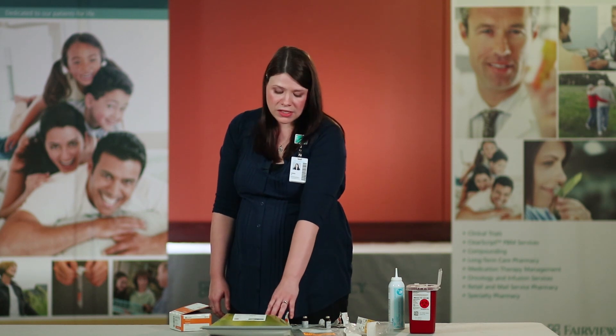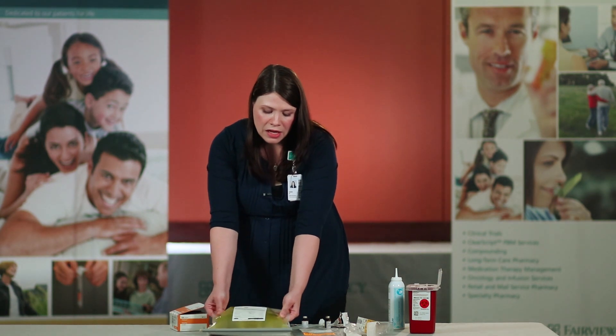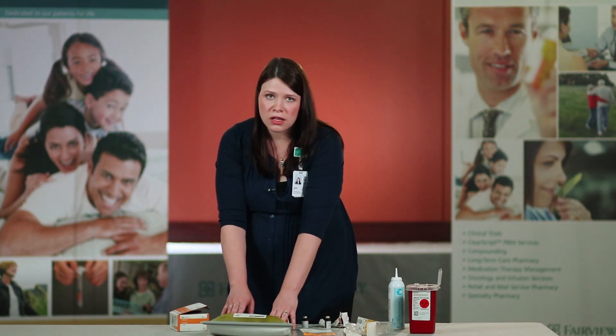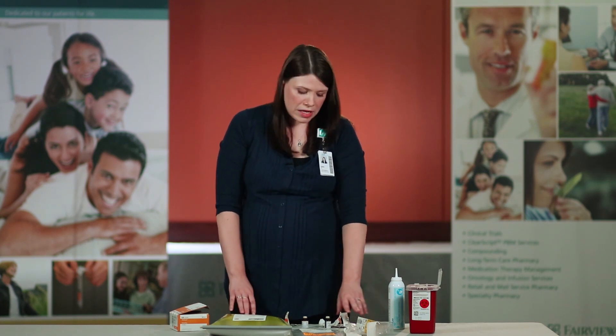It's good to note that one of your vials of multivitamins is actually yellow in color, and after you instill it into the TPN bag, your TPN does change color slightly. Also, all of your supplies that are not sharps can be disposed of in your regular trash.